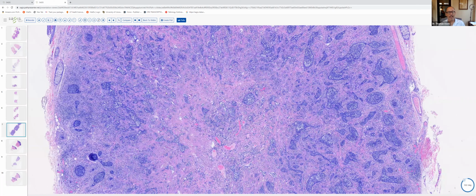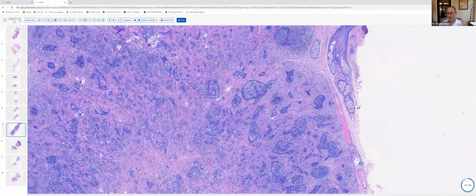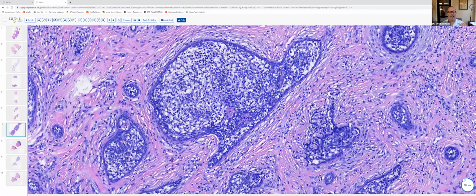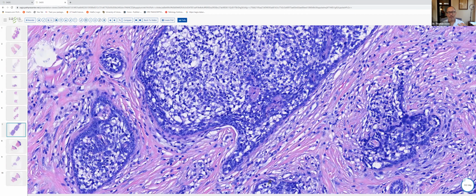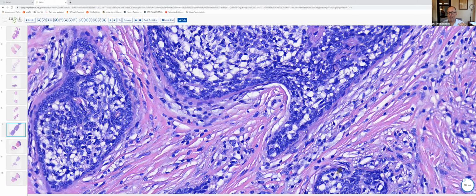You can begin to see animal shapes in these tumors. So, the animal cracker tumor. And yet, despite the variable size and shape of the epithelial component, when we look at each of these aggregates, the composition is the same. In each instance, out at the periphery, one can see a layer of cuboidal epithelium, which is somewhat palisaded around the periphery.